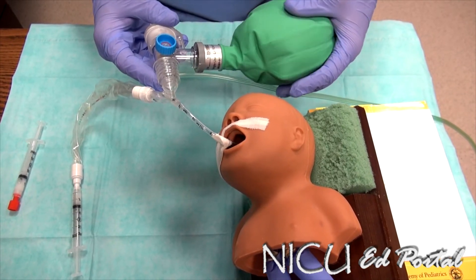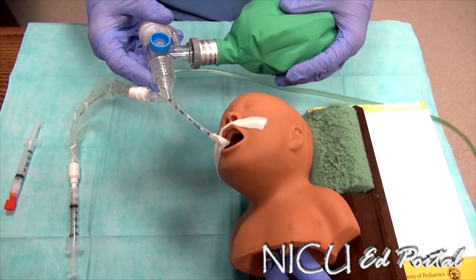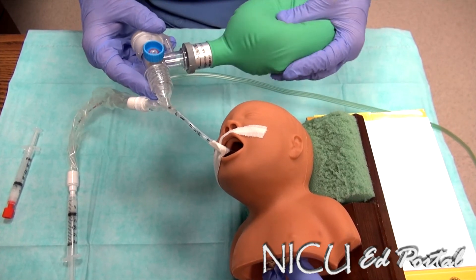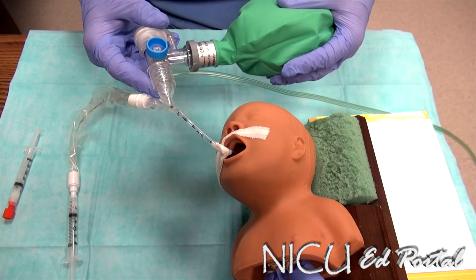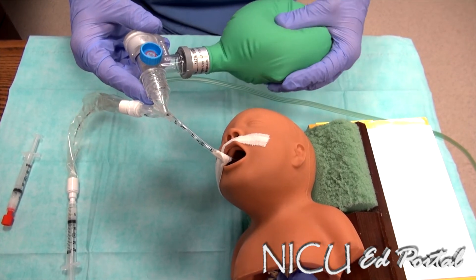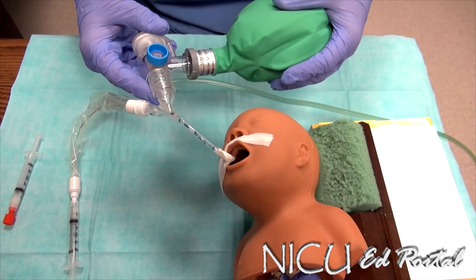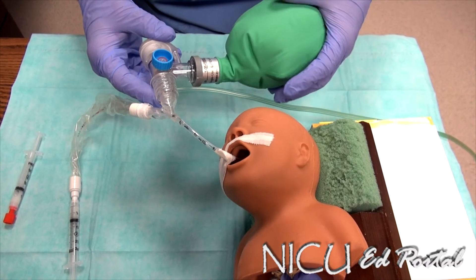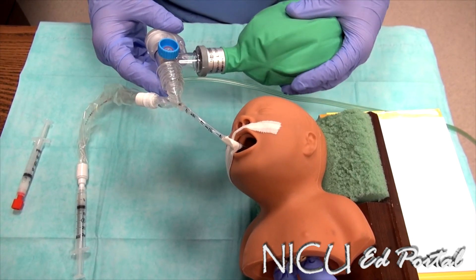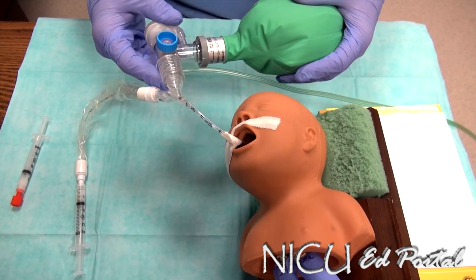After removal of the catheter, bag at around 40 to 60 breaths per minute. While on the right side, bag for one to two minutes, making sure vital signs are stable. As we come to the end of one to two minutes, with no remaining surfactant in the ET tube and vital signs stable, return the baby back to his or her neutral position. After administration, try to wait minimally one hour before suctioning.